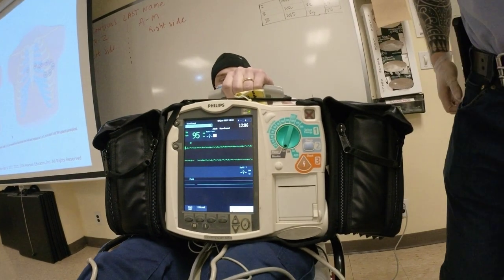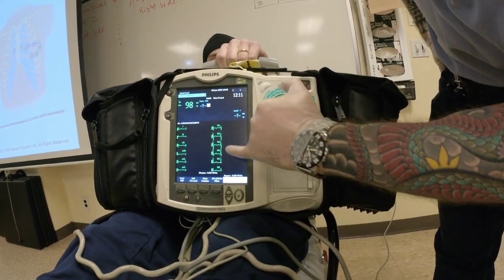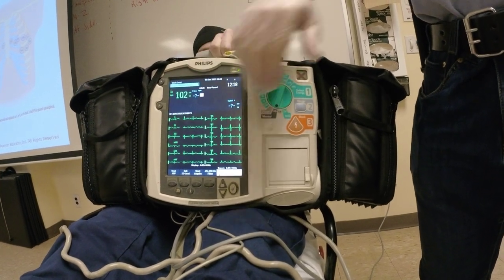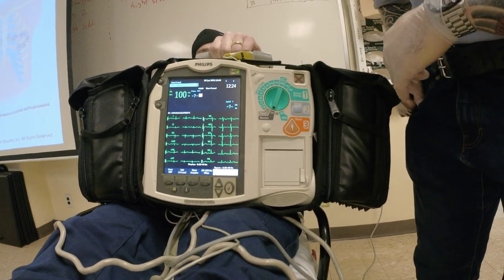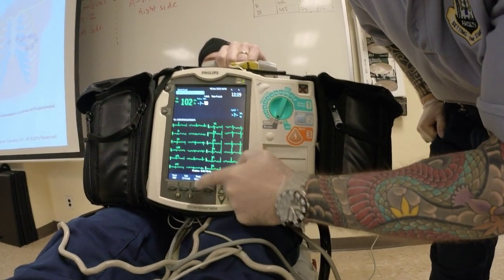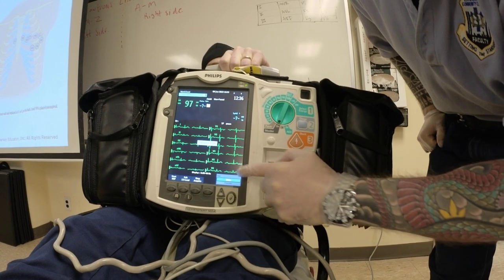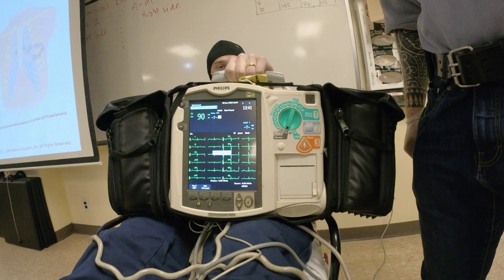So on this monitor, I'm going to click 12 lead. What I want to see is all of them come up on the screen, and I'm going to wait until my waveforms are good. My baseline is good. Everybody see that? I'll run this. I'll ask, sir, how old are you? 27, right? The reason you need this is for the algorithm. So I will click here, start acquire, and then it's going to ask me the age. I'm going to put 27. Male, check. And this portion is where you want to have them not move as it's acquiring.